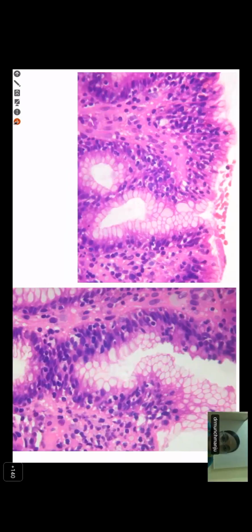Is there any chronic inflammation in the lamina propria? A little bit, mild lymphocytes, a few occasional plasma cells here and there. But the inflammation in the lamina propria is not so prominent; it's mainly lymphocytes inside the epithelium. Can everybody see the lymphocytes? Yes, ma'am. The lymphocyte nuclei look different from the epithelial cell nuclei, which are elongated and paler. The lymphocytes are dark, round and oval and often have a little halo around them.